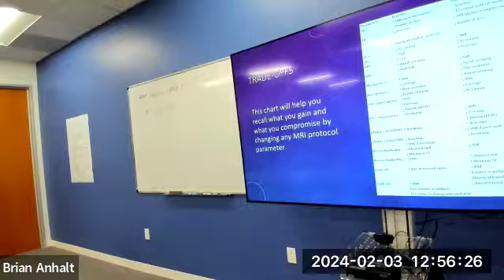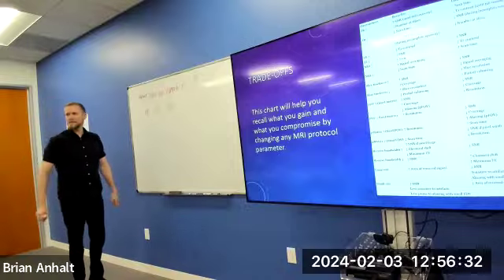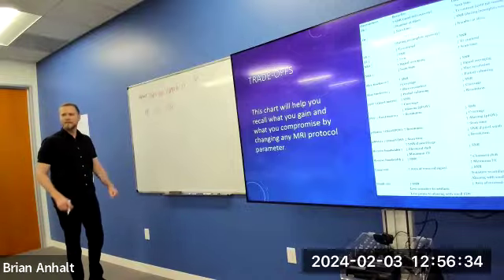So if you can tell me what does happen, you should be able to pick out what doesn't, right? So what does happen? What happens if we increase the TE from 60 to 100?